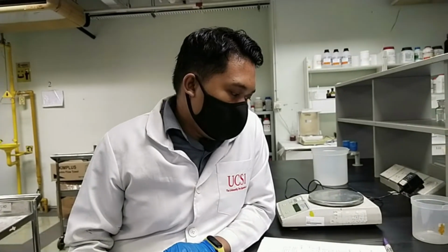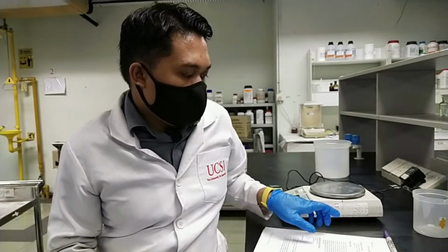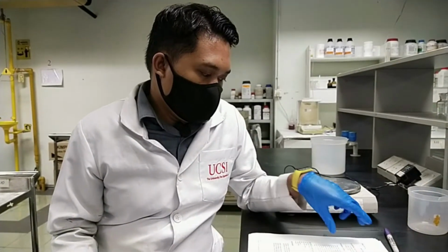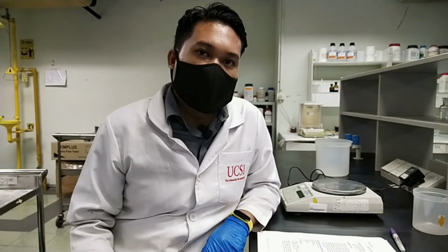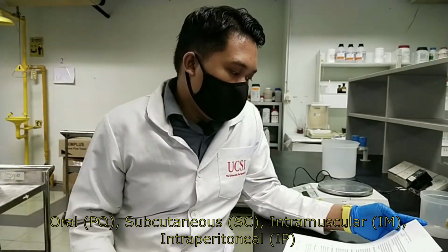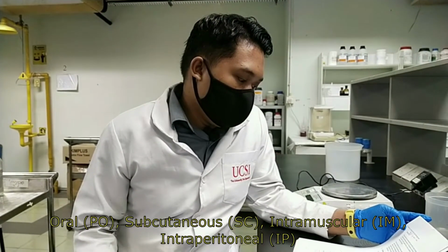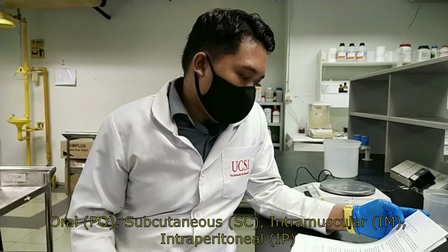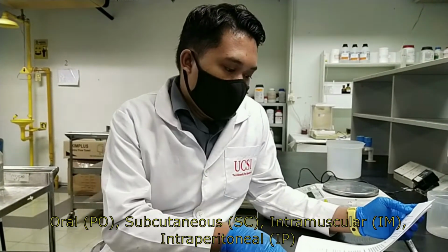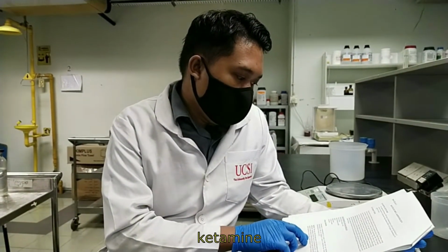So for today I'm going to show you a demonstration for practical number 3, BP131, Routes of Drug Administration. For this practical, I'm going to show you 4 different routes of drug administration, which are the oral route, the subcutaneous injection, or SC, intramuscular injection, or IM, and also intraperitoneal injection, or IP.